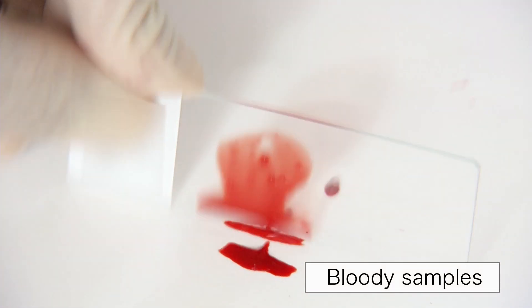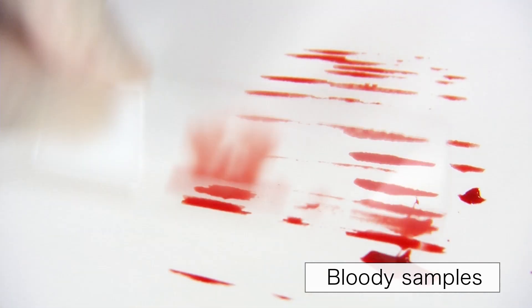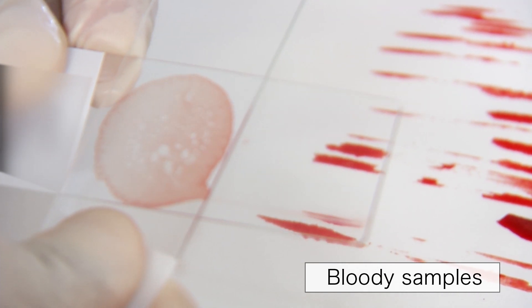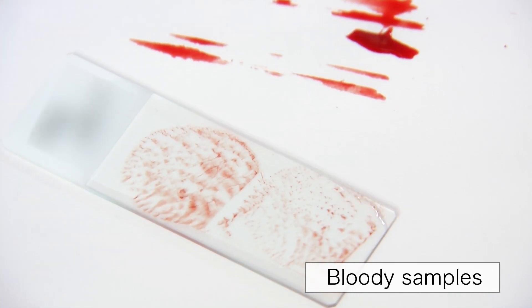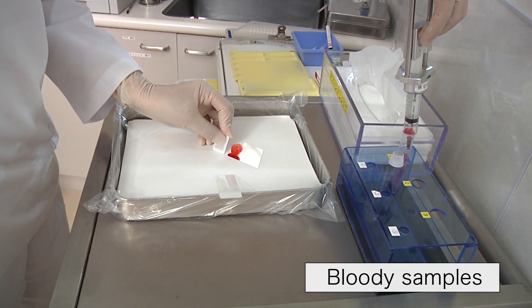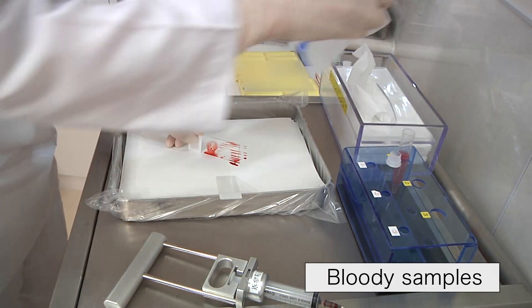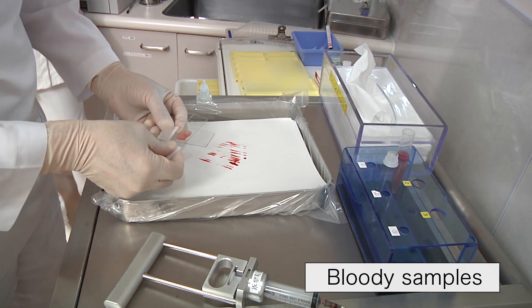When we obtain bloody samples, we tilt the glass slide and tap it. Then, we wipe up the components flowing from the glass slide and perform the press and release method. At the same time, we rinse the needle with a fixative for liquid-based cytology to obtain more samples. This procedure should be performed as soon as possible because the blood components quickly coagulate in the needle.